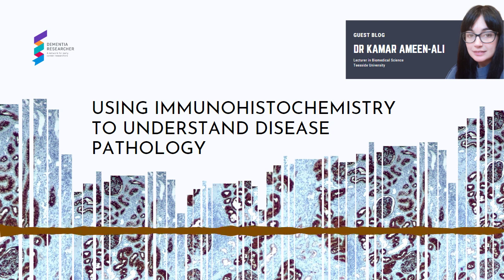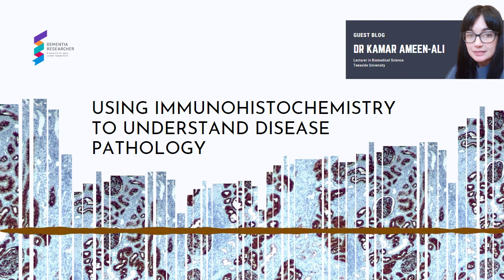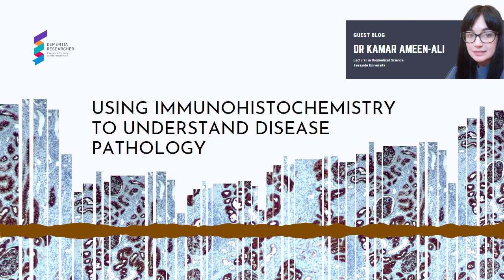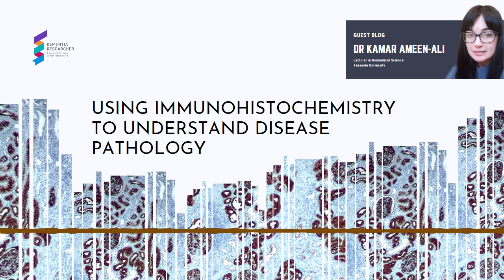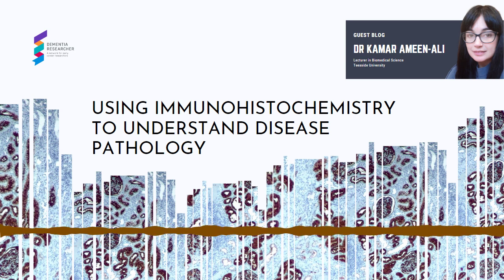Firstly, some biology. Our organs comprise different tissue types, which in turn comprise different cell types, and these cell types will express various proteins, which, in this context, we can call antigens. In simple terms, immunohistochemistry is the method of using antibodies to bind to specific antigens to allow us to visualize certain cells or the proteins expressed by them.